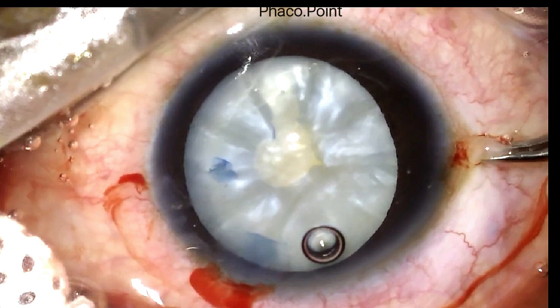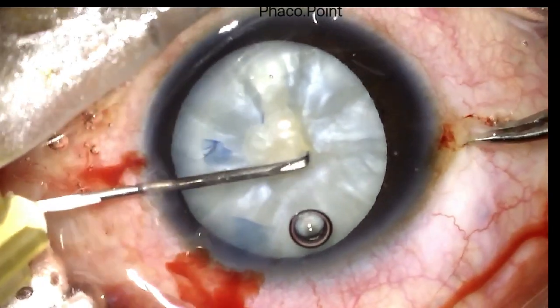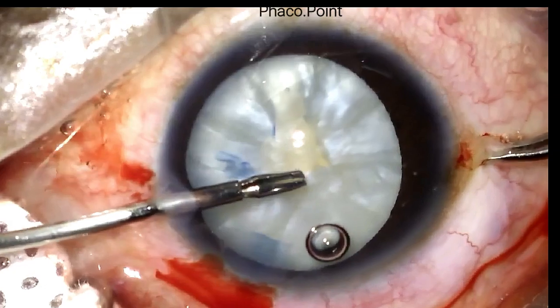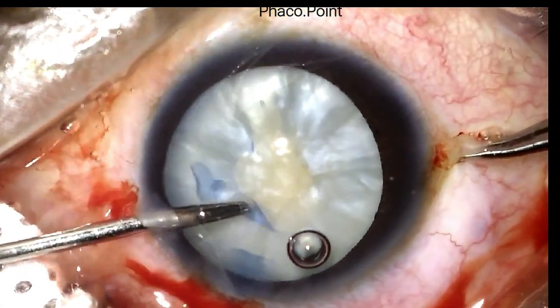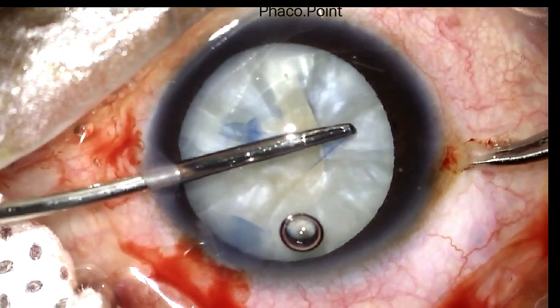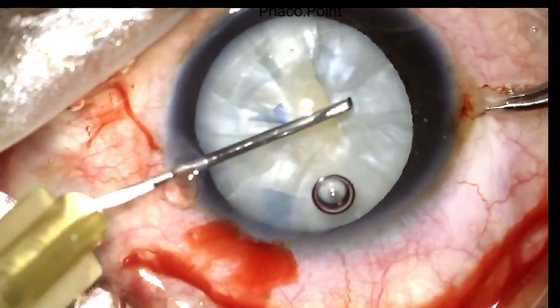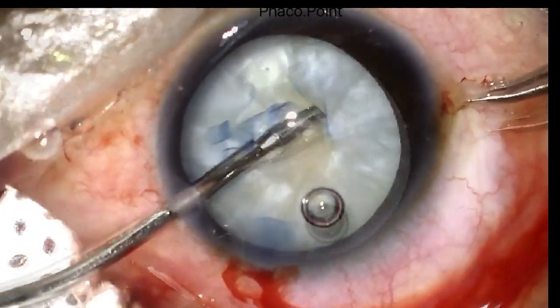The first step is to enlarge the capsulotomy. After fixating the eye with the help of a cystotome, I make a tangential cut in the anterior capsule. I hold on to the tear thus created with the help of an intraocular forceps and attempt to enlarge the capsulotomy. In a similar manner, I further enlarge the capsulotomy between the 6 and the 9 o'clock position.